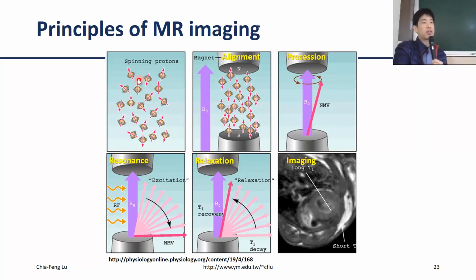However, in your body, these small magnetic fields or vectors are actually aligned randomly. So there is no net magnetic field, because all the magnetic vectors cancel out each other, since they point in different directions. But once you send a patient into the MRI room, we know the MRI room has a very, very strong magnetic field. The magnetic field unit is Tesla. Tesla is so strong that it is over 10,000 times the Earth's magnetic field. It's pretty huge.